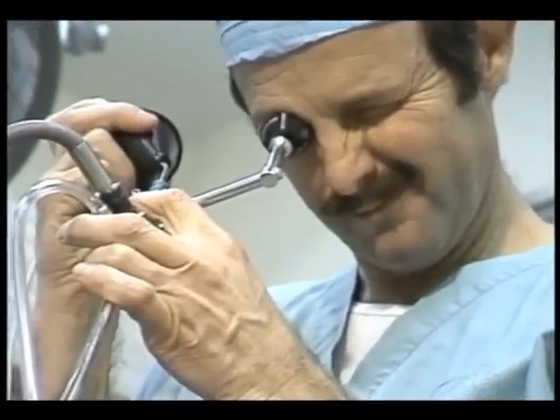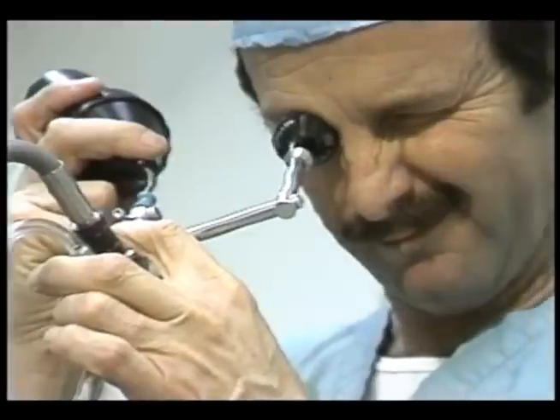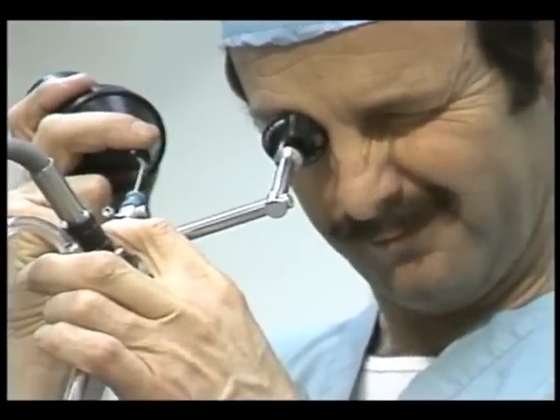The doctor will make a tiny incision in the side, pass the scope through the body and into the kidney, and identify the stone. As you can see, the stone breaks up, and these small pieces can then be sucked out through the tube — literally out of the body.